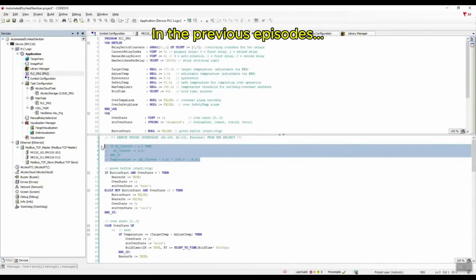The first condition is converting milliamps to degrees Celsius. But this block of code is commented out, since the analog input module from akYtec handles this task for us.